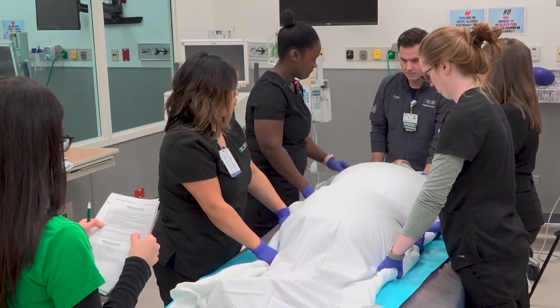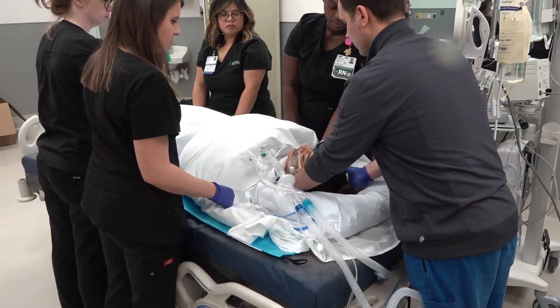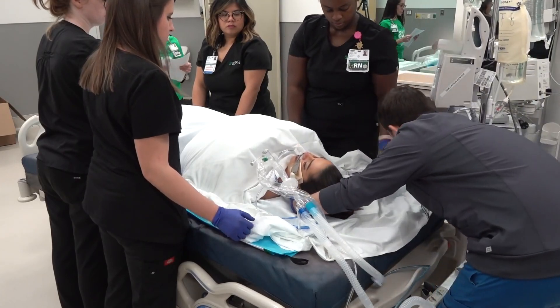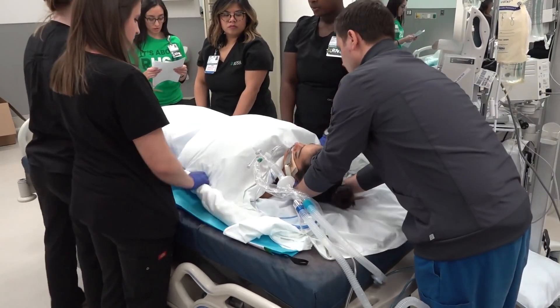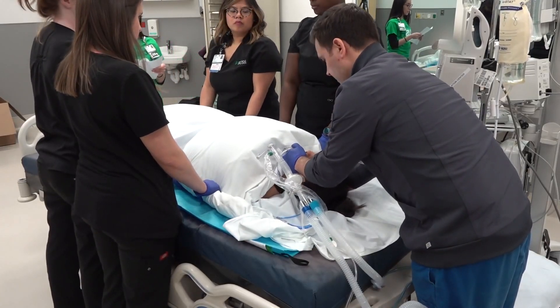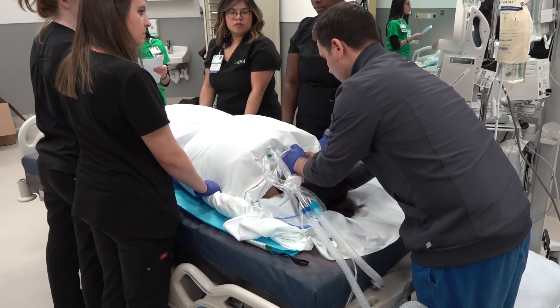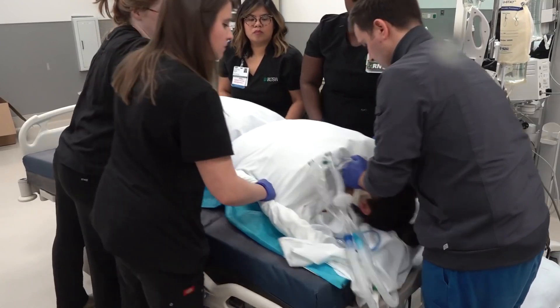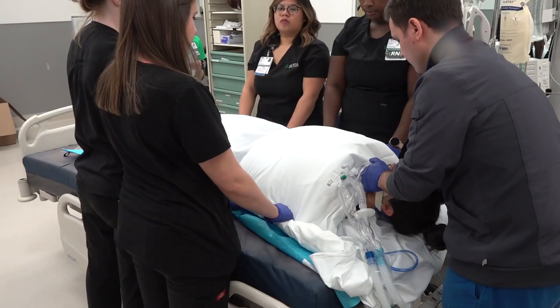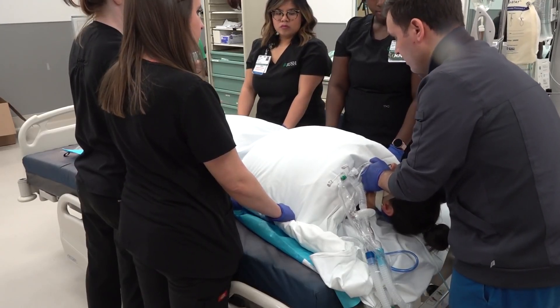At this time, the respiratory therapist will remove the patient's pillow and place their hands in the position described earlier. If the respiratory therapist requests it, on the count of three, the patient will be boosted up to the head of the bed. Then on the RT's count of three, the patient will be moved horizontally farthest away from the ventilator.